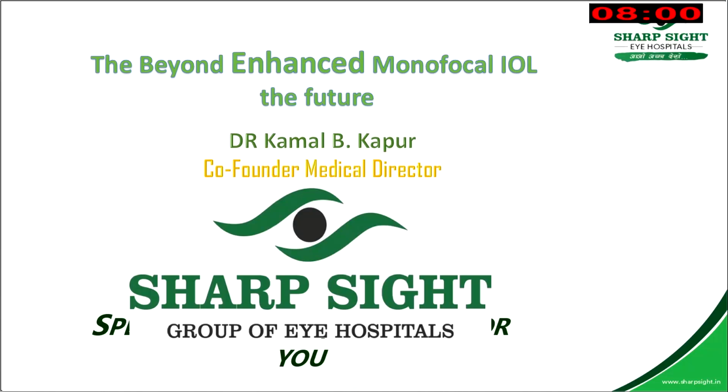If your lens has rotated more than 30 degrees, explant it. No use redialing it again, it'll again rotate. So, little practical points. Now coming to my topic.